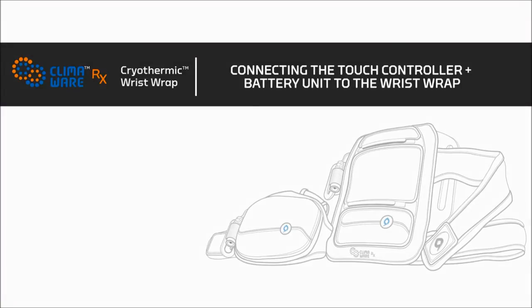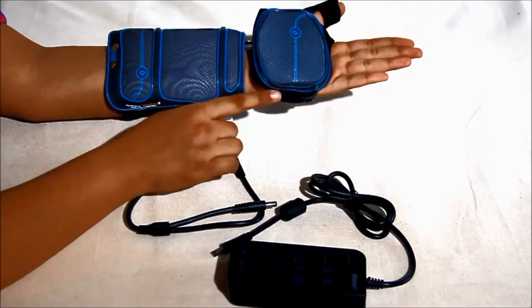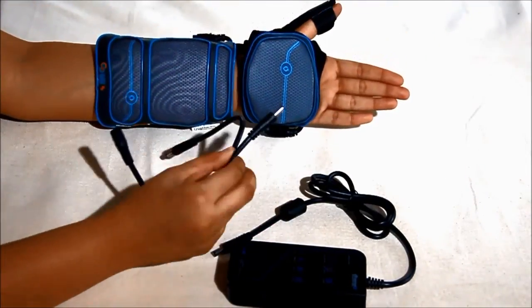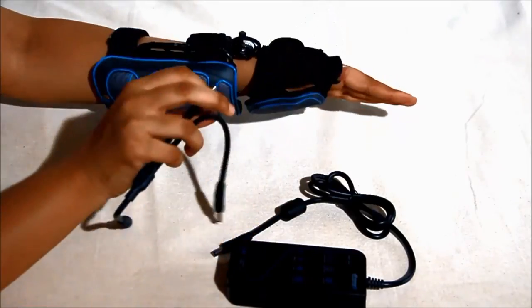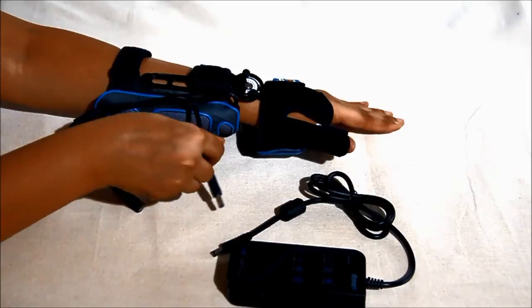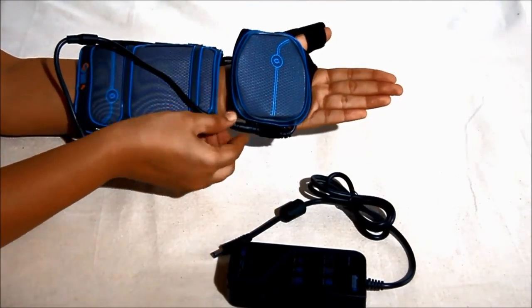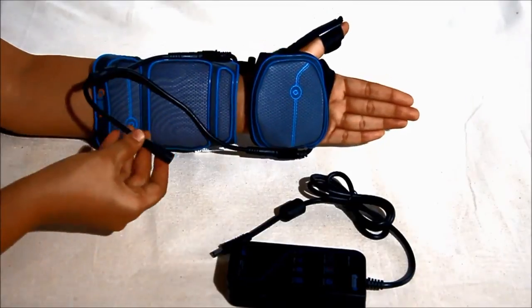Let us see how to connect the touch controller and battery unit to the wrist wrap. When using the wrist wrap with the thenar eminence wrap, connect the female connector of the Y extension cord provided to the male connector on the touch controller and battery unit. Then plug in the male connectors of the Y extension cord to the wrist wrap main body and the thenar eminence wrap.